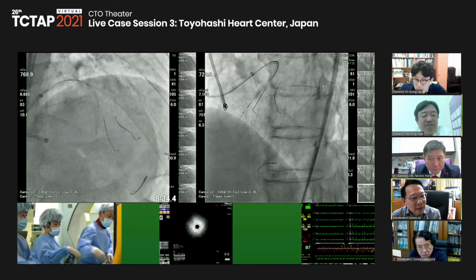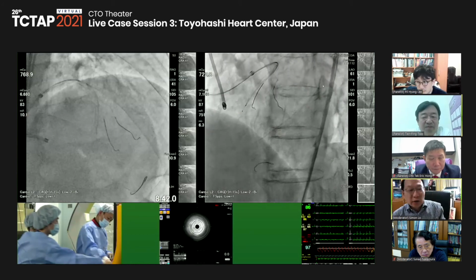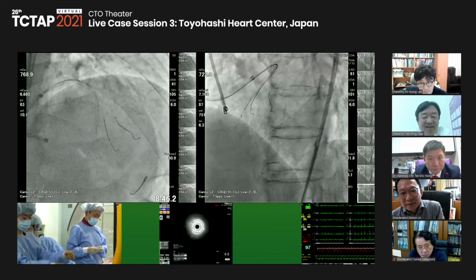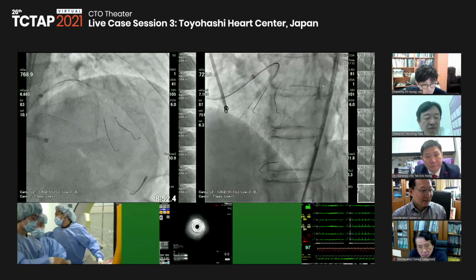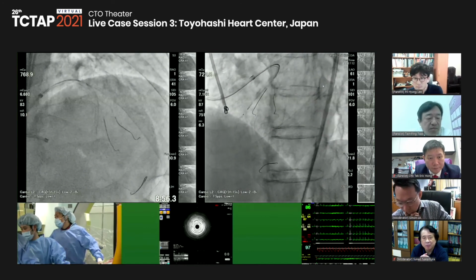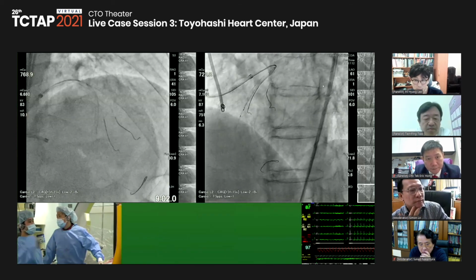Uh-huh, I see. What about putting a 3.0 NC balloon and inflating it to very high pressure, like 18 or 20? Would that be sufficient, you think? From the IVUS, maybe 2.5-ish.